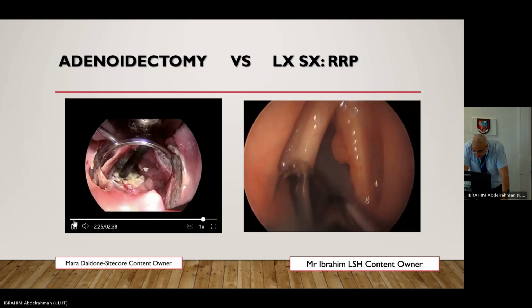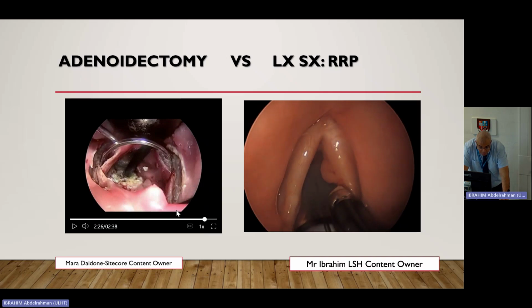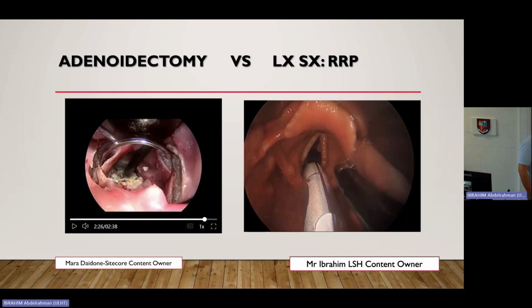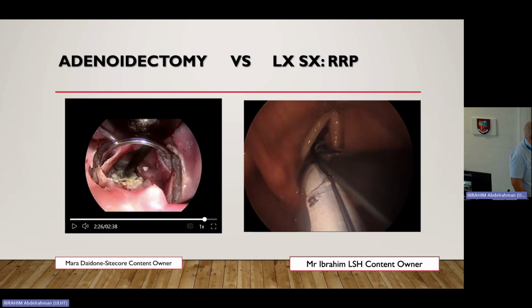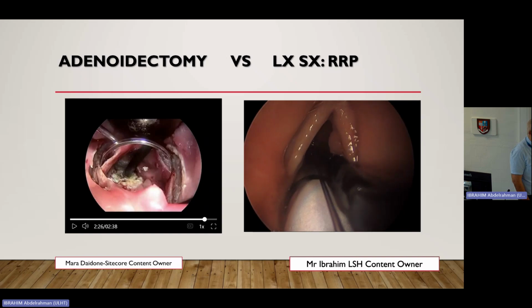This video came from my colleague, Mr. Abrahman, using coblation for recurrent respiratory papillomatosis. Okay, it has been used. Does anybody know what recurrent respiratory papillomatosis is? Any ideas?